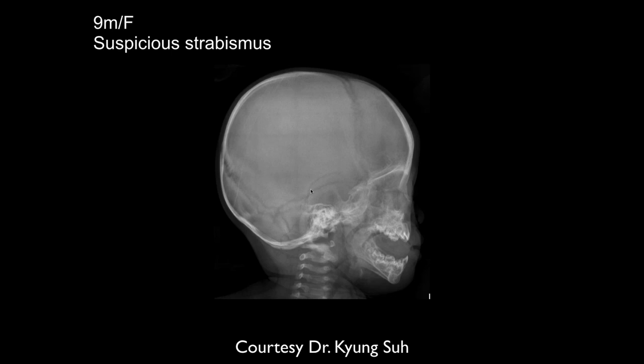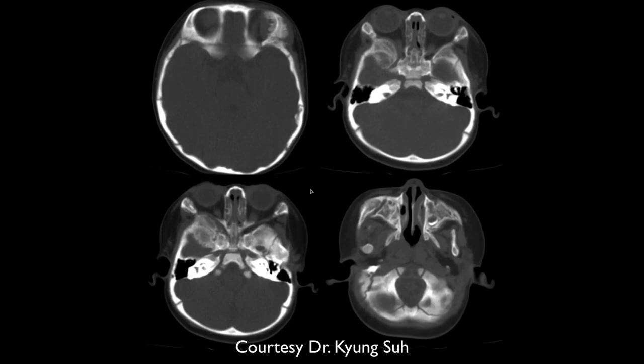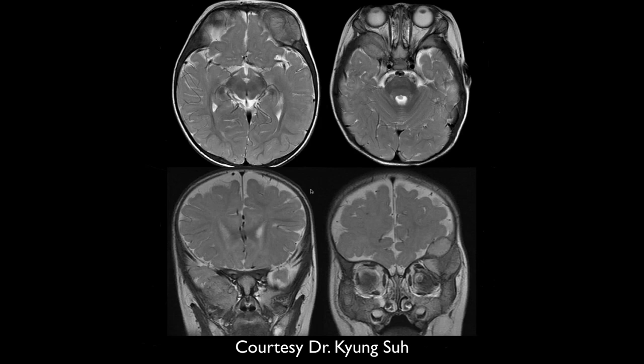Okay, 9-month-old female, suspicious strabismus. Okay, so on the left orbit, it seems that we have this hair-on-end appearance. I'm thinking of neuroblastoma, and also in the right sphenoid bone, the same appearance. I'm thinking of metastatic neuroblastoma first. Yeah, soft tissue masses, left frontal, right sphenoid.